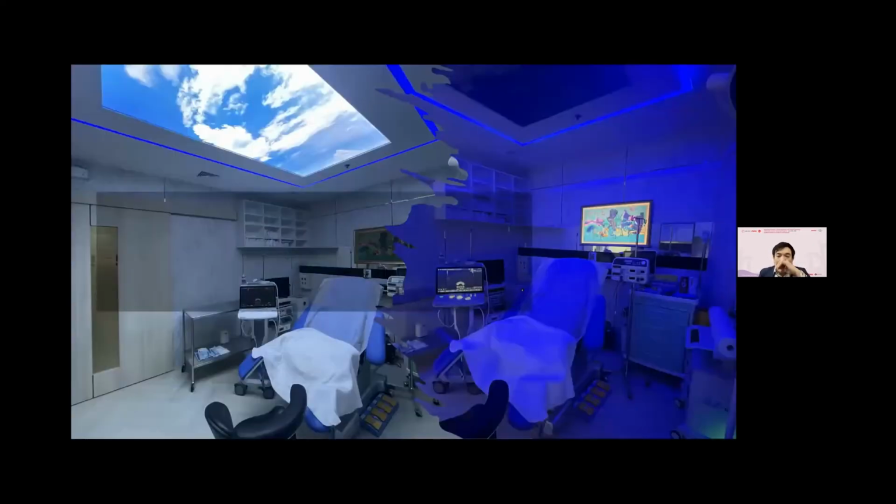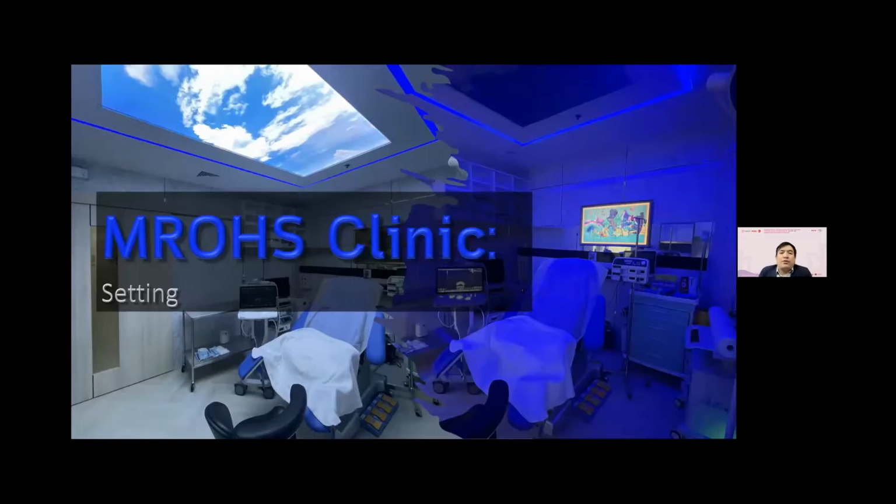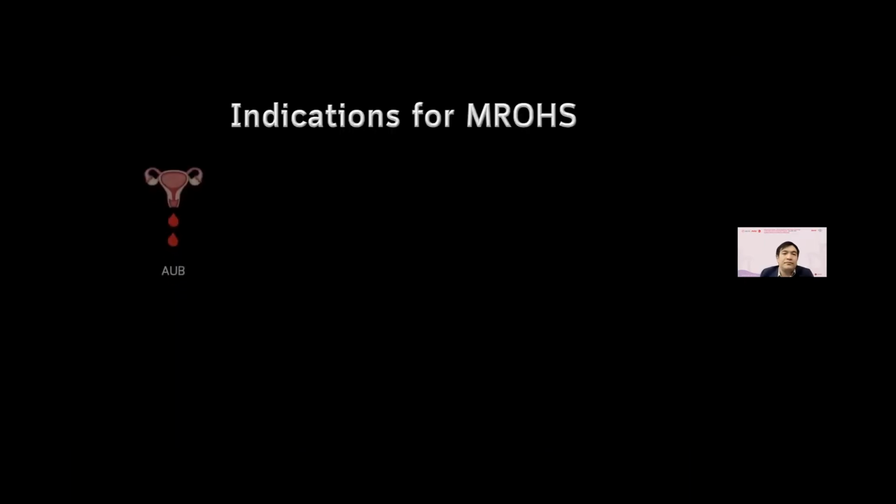And this is the setting. We create a relaxed environment for the patient. This is from my operating theater. So you see that it's more relaxing. The patient can see the sky, and we also adjust the light to help with the visualization.